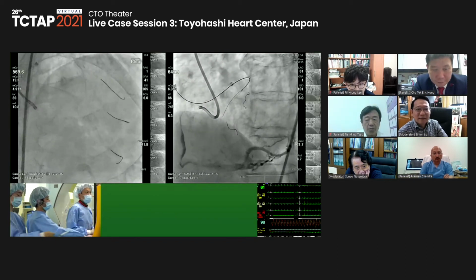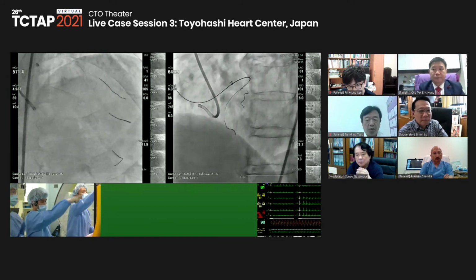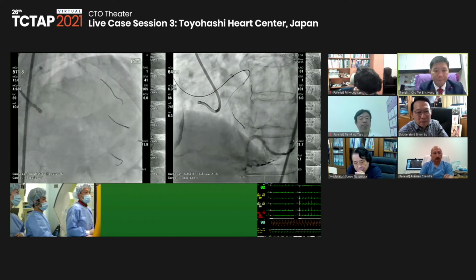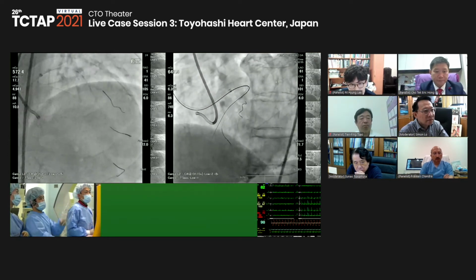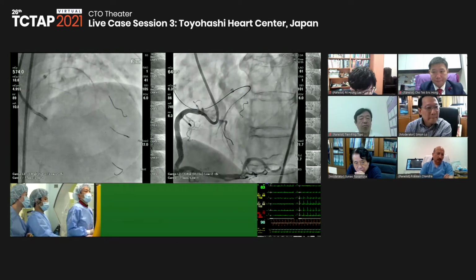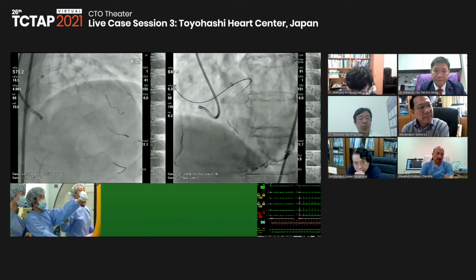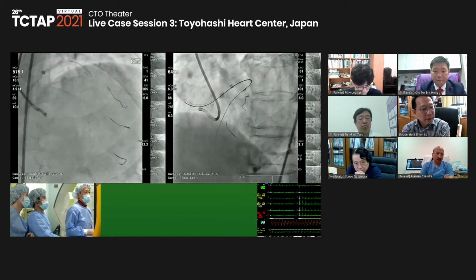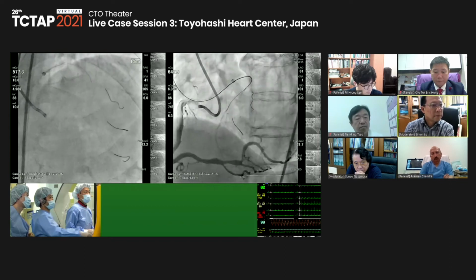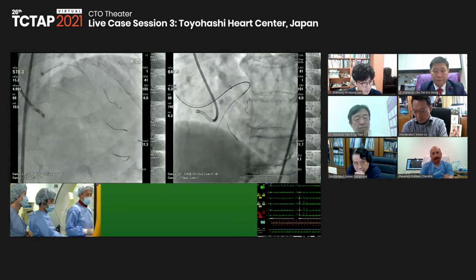And also nowadays maybe, I want balloon protection for when we stent in the LAD.